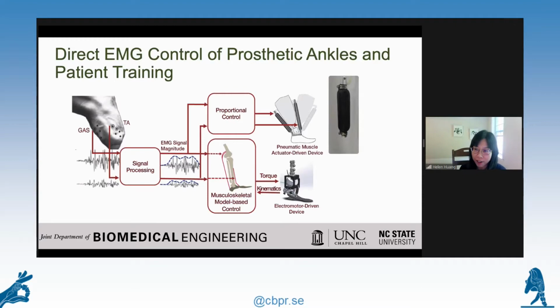So we actually did multiple studies, all the way to here, because of my time limit. I'm going to show you that we have started working on using EMG to directly control a prosthetic ankle. And there are two controlled ankles.